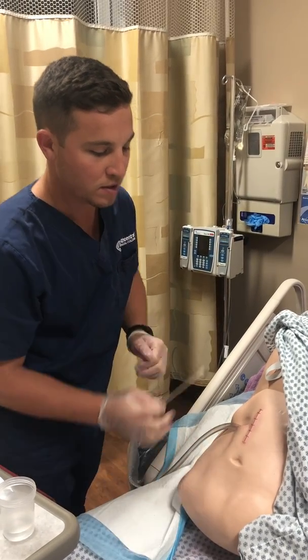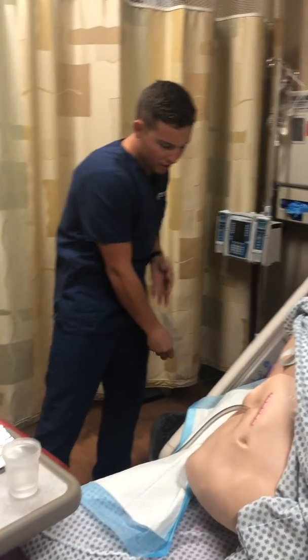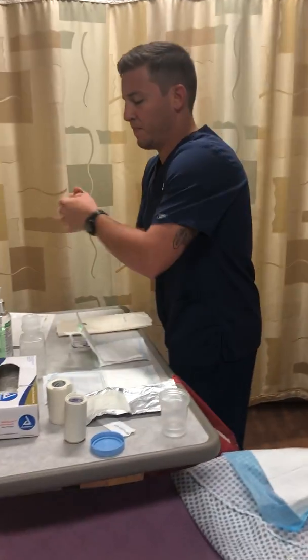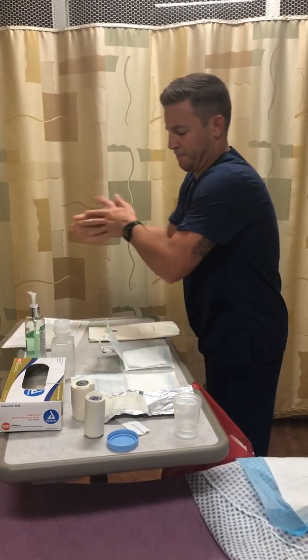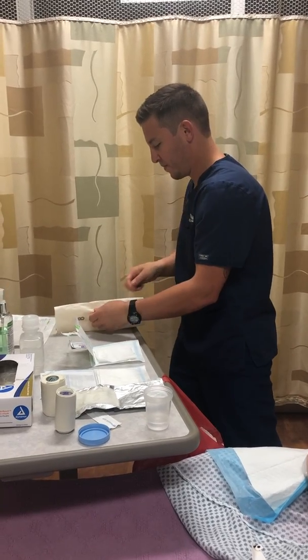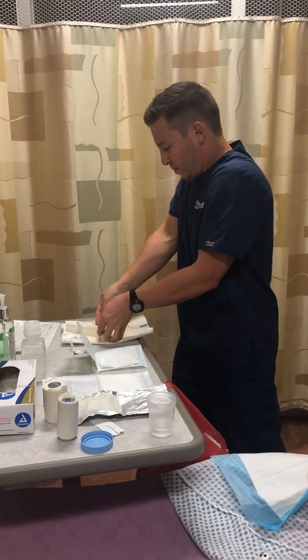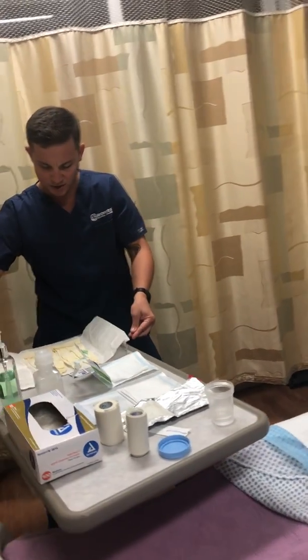Okay, so now that this is clean, we can put on our sterile gloves here. Noting that the outside 1-inch border is considered not sterile.